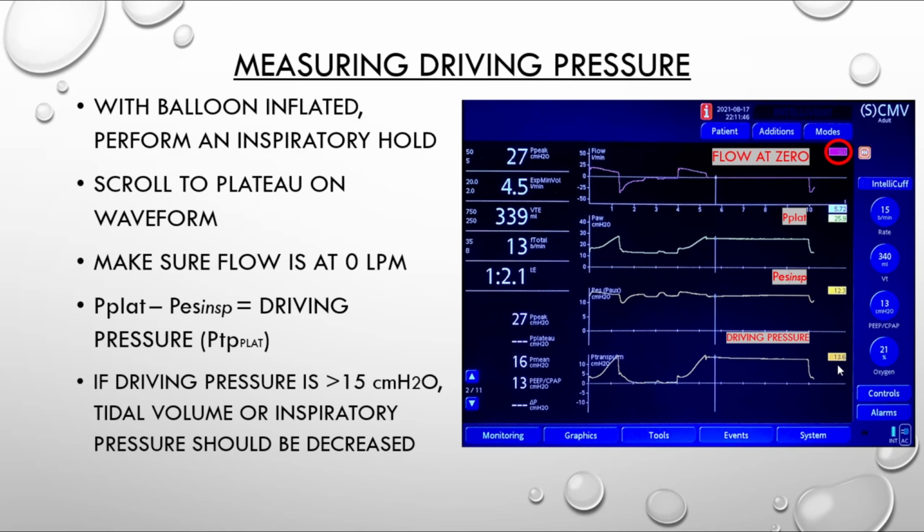Here at Cottage, we like to keep the driving pressure below 15, that is our policy. But you can find some other studies that say maybe even going up to 20 is acceptable. I think I've even seen one that said up to 25, but the lower the better on this.